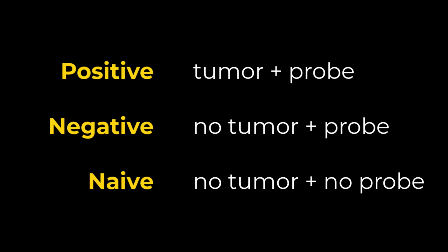Careful comparison of positive and negative control mice helps us understand the role of any non-target related signal. This could include tissue signal related to metabolism or clearance of the reagent. Now that we've discussed the control groups, let's move on to the actual experiment. Our goal is to image the biological activity involved in 4T1 tumor progression using fluorescent approaches.